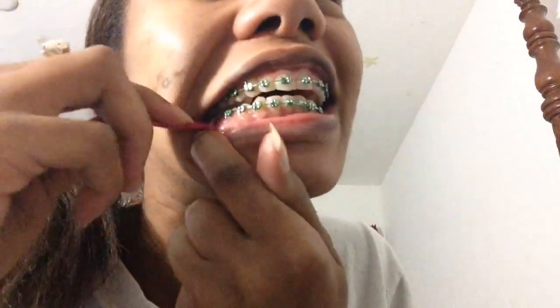On the right side I have a crossbite, it goes like this. In the back I have a hook back here and I take it and I ring it all the way in.